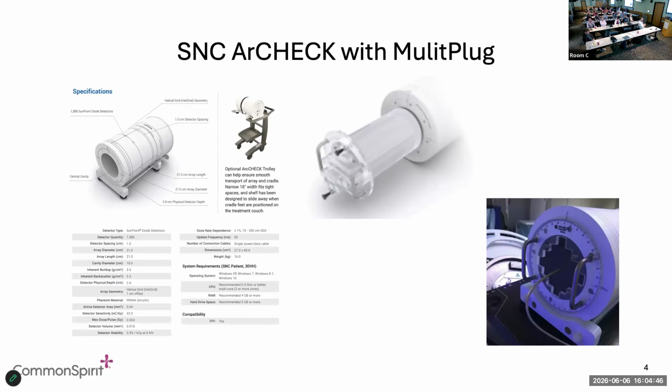So, talking about the SNC ArcCheck with the multi-plug. The reason for the multi-plug is that it allows you to put the chamber in the middle there, and I'm sure everybody's familiar with this device.